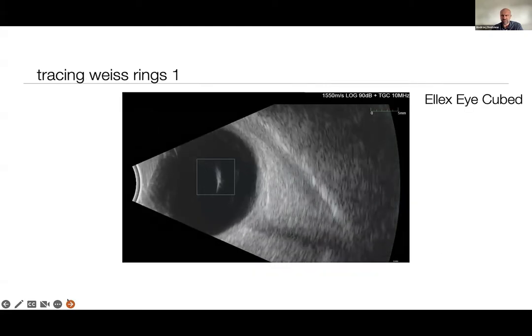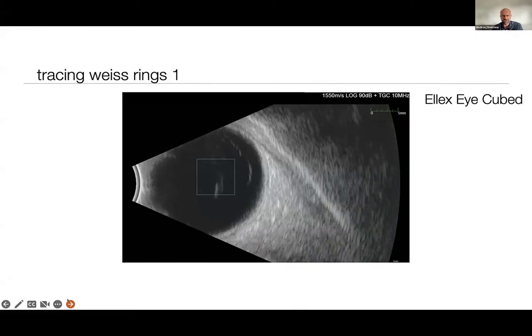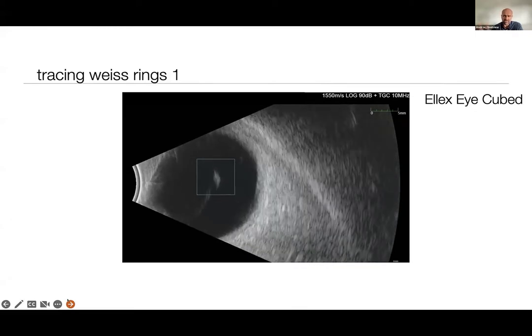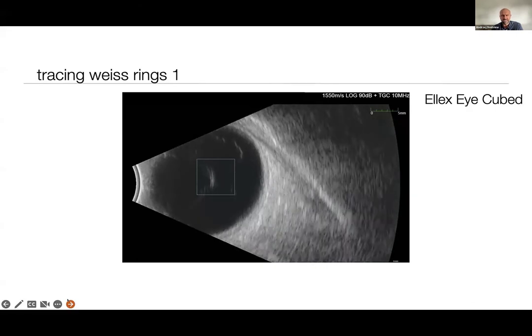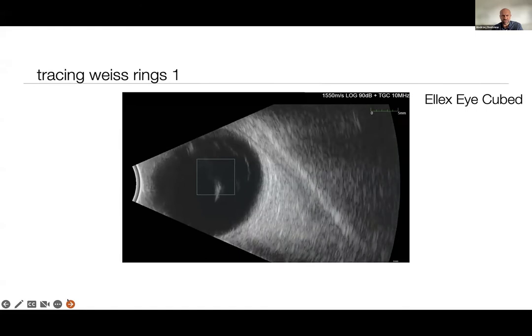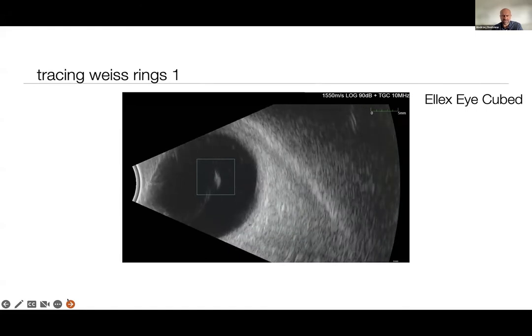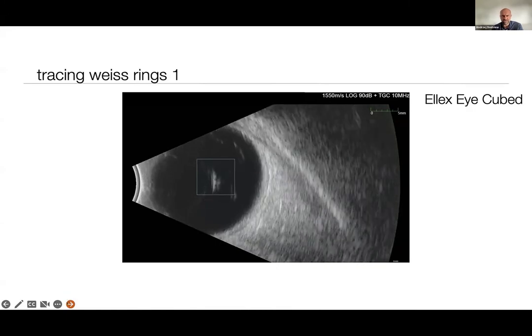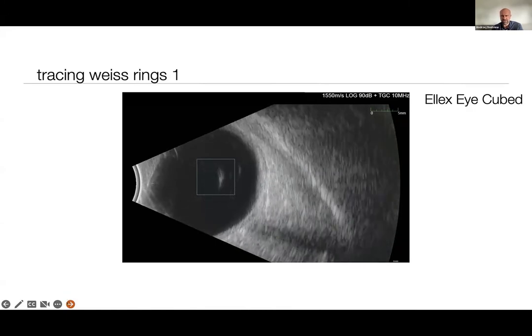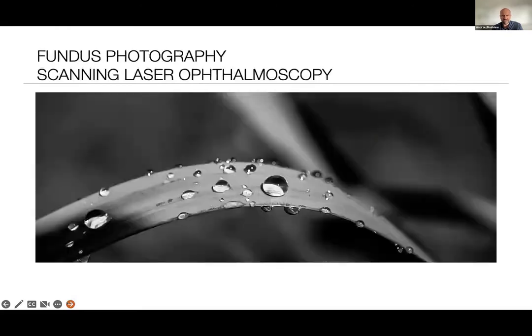And that's another approach with the iCubed, a machine I've been using for years, and especially in the beginning of my career with floaters, we used iCubed machines to assess those distances. Something that I don't do right now in every patient I'm treating, but still I would definitely advise it in people who are starting their career in floater treatment.